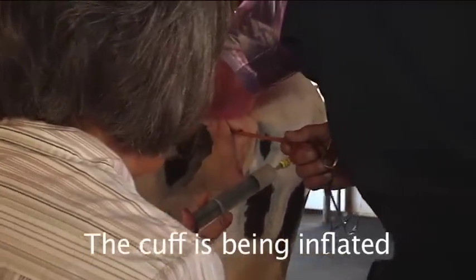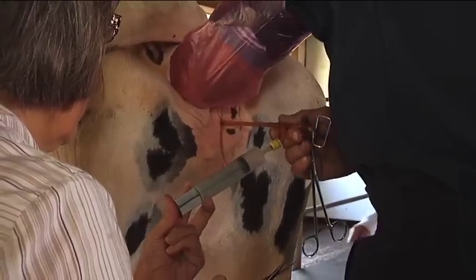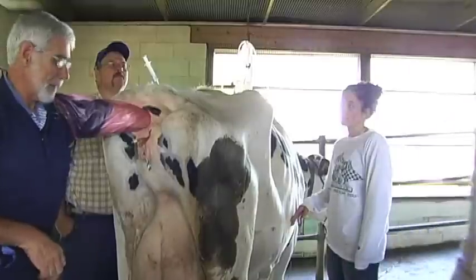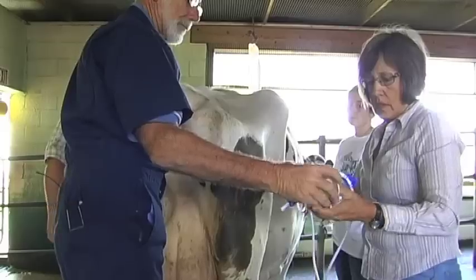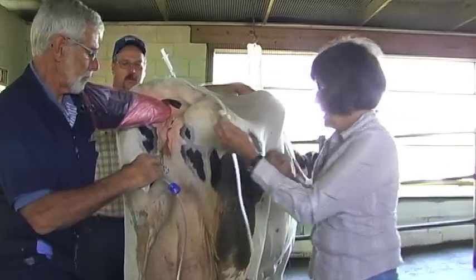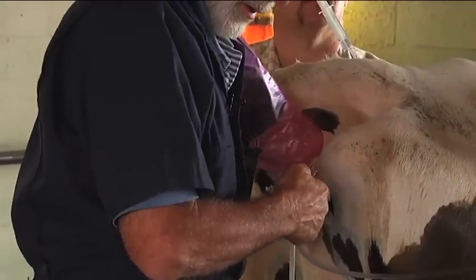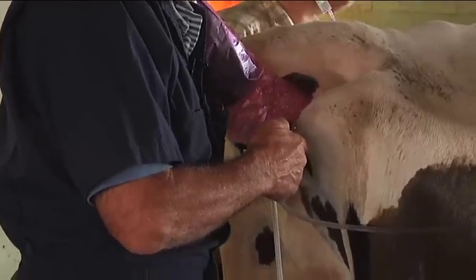Air is counted in — 15, 16, 17, 18, 19 — confirming the catheter is in the left horn with the cuff inflated to keep it in place. The left horn is then filled with medium and emptied. A series of fills and empties is performed to wash out that horn.